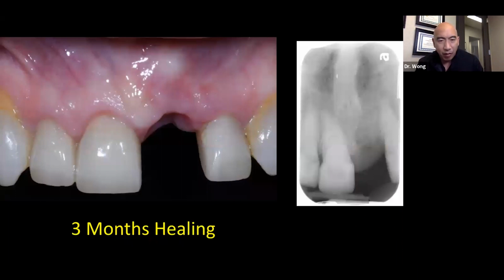Okay. For a bridge, you want an ovate pontic that goes 3 millimeters subgingival. But for an implant, you don't want it touching the tissue. So here the flipper was a little bit too aggressive. And you can also see it was a little aggressive on the distal papilla too, kind of pushed on it. So that's what affects the soft tissue in this situation.